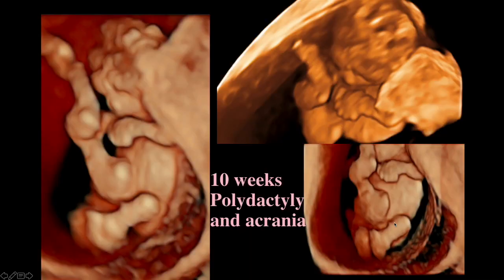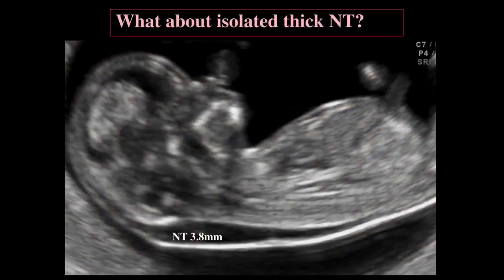Now, this is the earliest case. This turned out to be Meckel-Gruber syndrome when it was tested. This is 10 weeks. You can see the cranium's gone. That's obviously what first caught our eye. Then transvaginally, you get more detail. And the first thing we saw transvaginally was all of these digits here, and on the feet and on the hands. And this ended up testing positive biochemically and genetically for Meckel-Gruber syndrome.